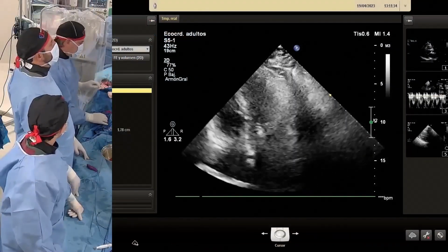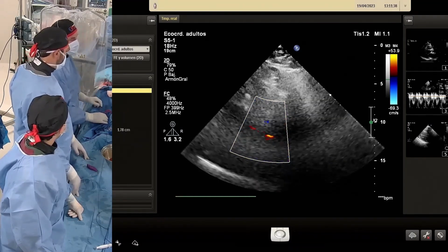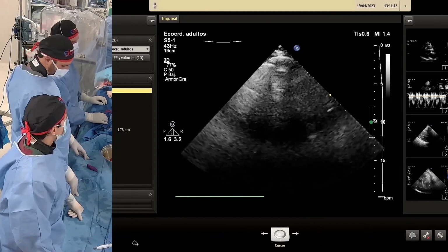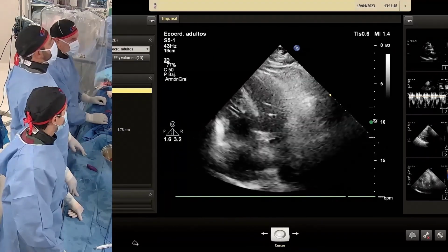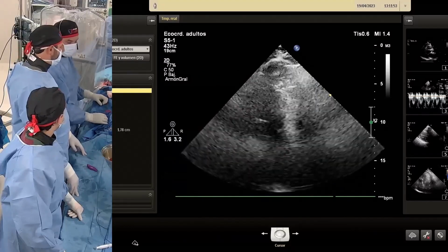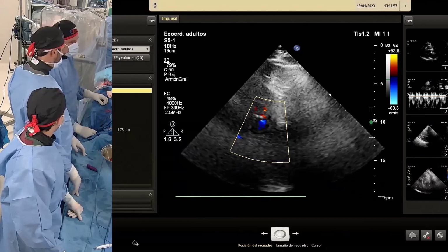She has conduction disturbances. She has AF and also a block of the right bundle branch. So this is a patient not for being discharged the same day for sure. We will leave the pacemaker. This is afternoon, so probably until late today or tomorrow morning, according to our working hours today.